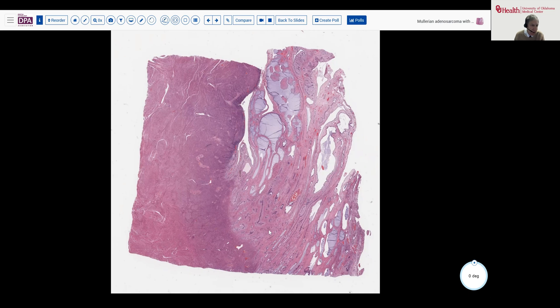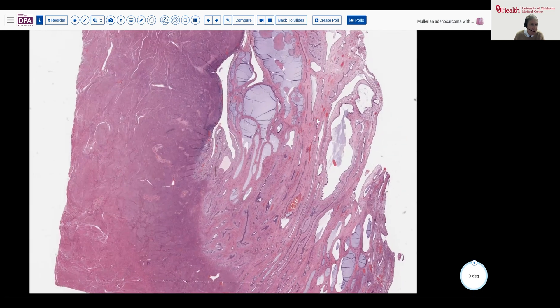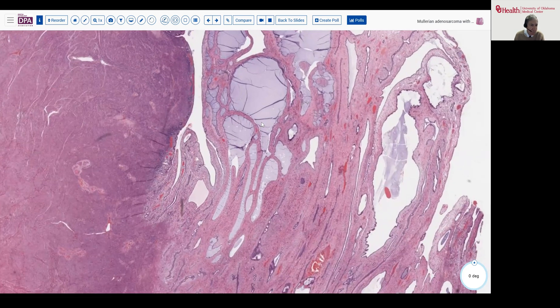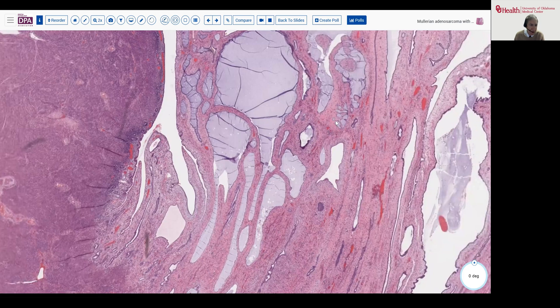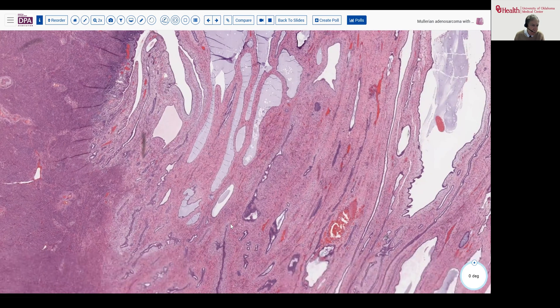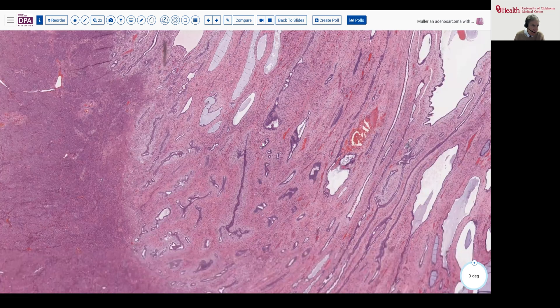This case illustrates the value of a little higher magnification at times rather than just rapid dismissal. And what are the clues here at low magnification? One clue is these sort of linear, somewhat compressed glandular structures with a little bit of leafing or tufting to them. These glands here should suggest to you that there may be something going on in the stroma. At scanning magnification, you can't see much else, and the stroma looks fairly bland because it's quite pink, not very cellular. Typical glandular luminal mucin is observed here. But as we come into a little higher magnification, you can begin to see that there's a little bit of stromal condensation around some of these glandular structures.